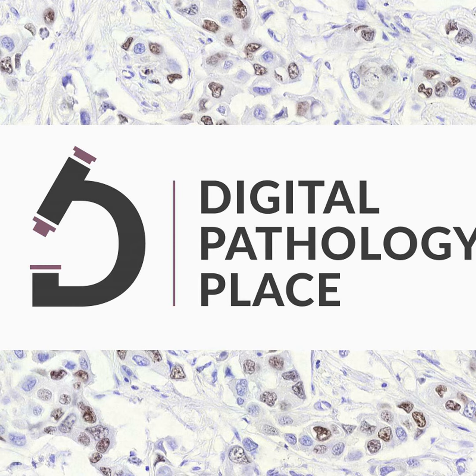Which also gives the researchers and healthcare professionals options to be compliant, because in different countries, the attitude or the regulations about cloud computing are different. I know that in Europe, it's required that, if there is an audit, there needs to be a physical location where the data is processed. And I assume the bare metal server is something that can be located physically, and that's where the computation is happening.